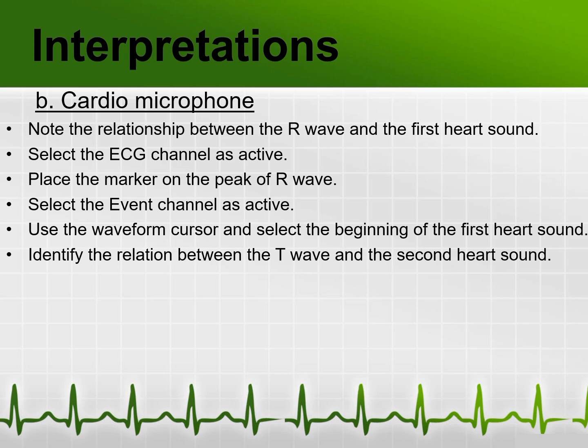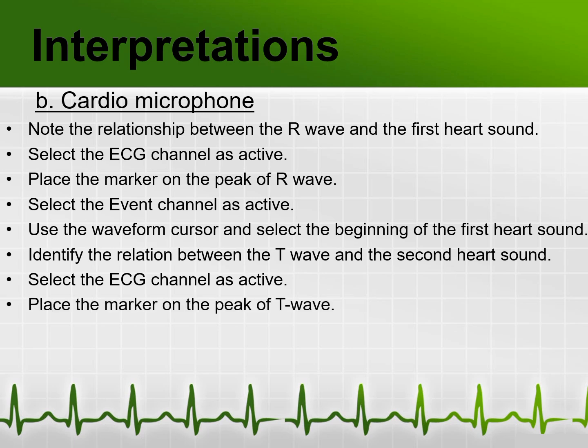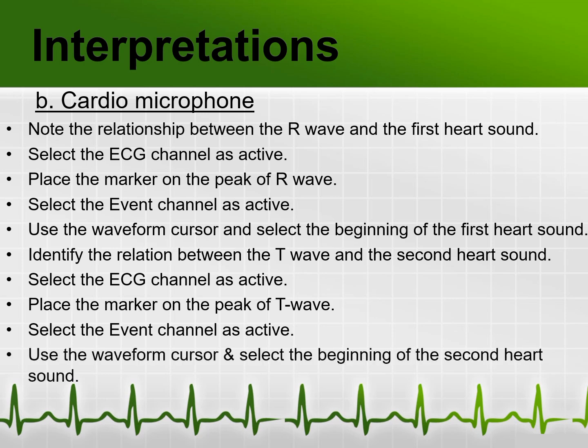Then select the ECG channel as active. After that, place the marker on the peak of T wave. Then select the event channel as active. Now use the waveform cursor and select the beginning of the second heart sound. Note this time.